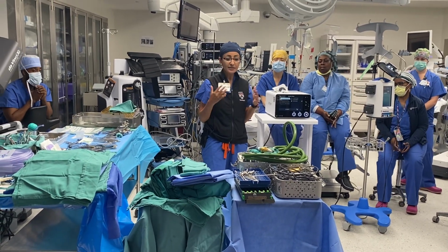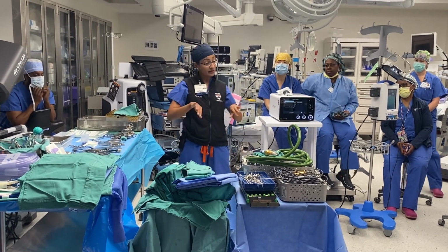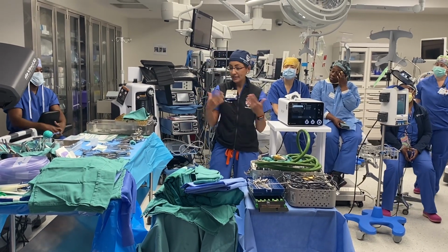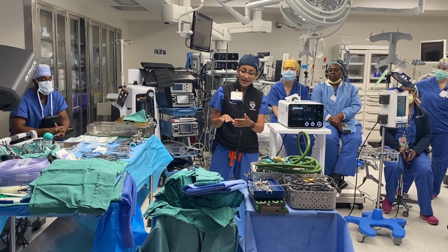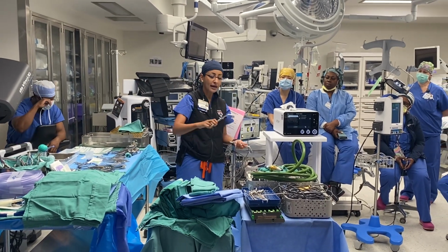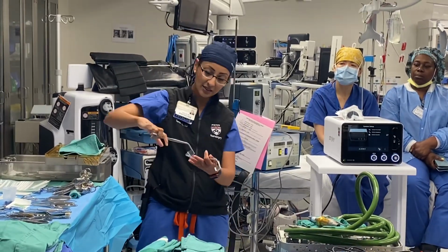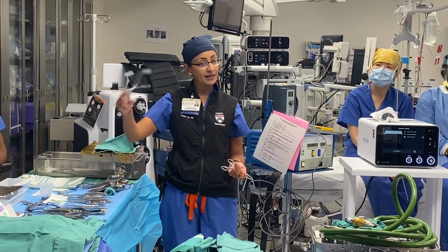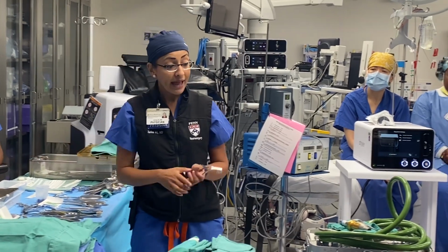And again, similar conceptually, we're now opening the skin, and in this case it's the back of the head, which has a lot more muscle compared to the top of your head. So there we're using more spine-like stuff, Bovies and so on. And then we love these cerebellars. You see us use this in the spine a lot. It's called a cerebellar because it has the same shape as the way the head is shaped there. Sometimes we'll also use the Raney clips, but these actually work pretty well to separate that scalp tissue.